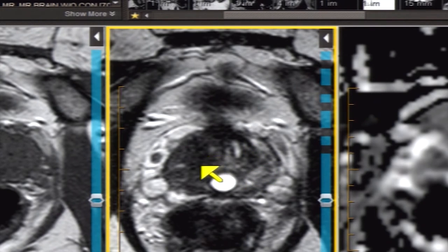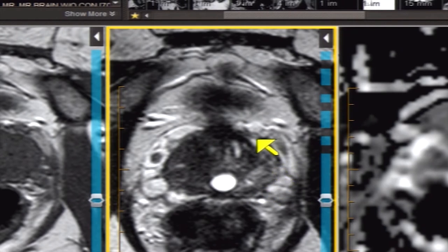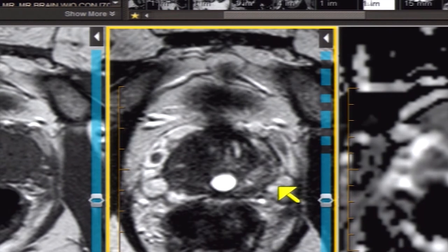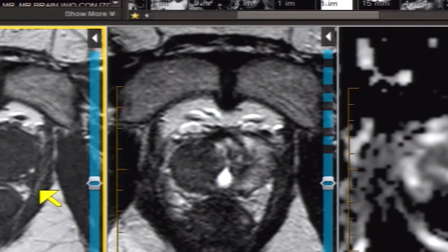On the right side you don't see the surgical capsule because it's been erased or transgressed by our dark smudgy charcoal sign tumor — a very important anatomic and signal sign of cancer. On the left side, the dark signal intensity represents the anatomic capsule, while the brighter signal intensity represents the periprostatic venous plexus, which can be seen on the T1-weighted image as slightly lobulated areas of intermediate signal intensity.